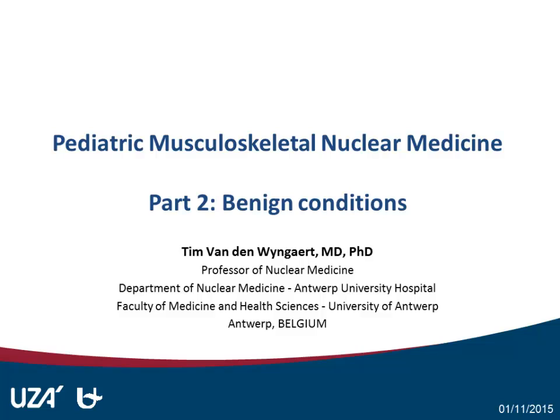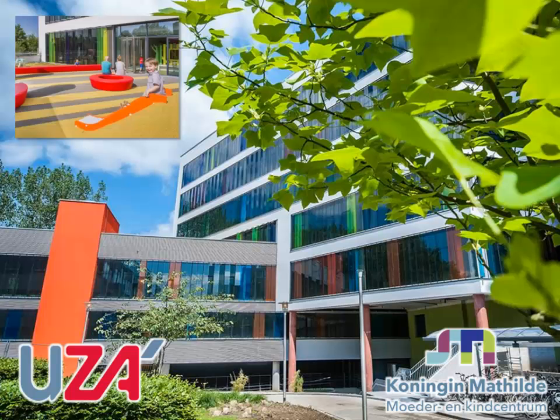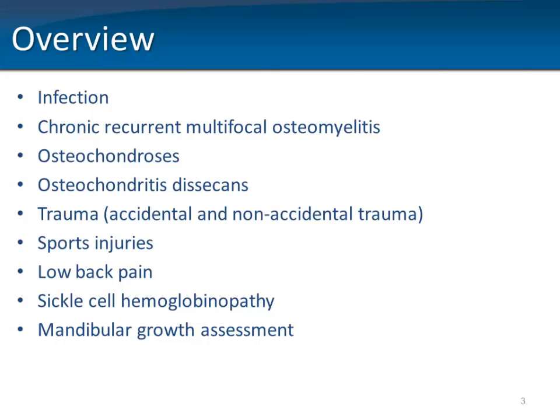With you in kind of an iconographic way the benign conditions for which I believe nuclear medicine can be useful in a child presenting with a musculoskeletal problem. So this is what I have put on the menu for this talk.